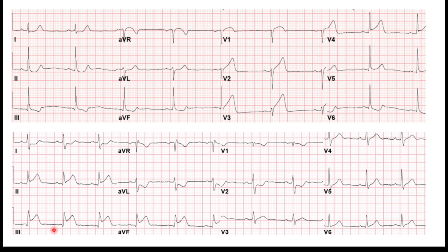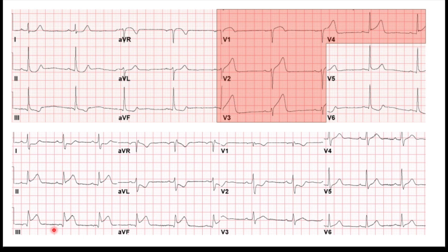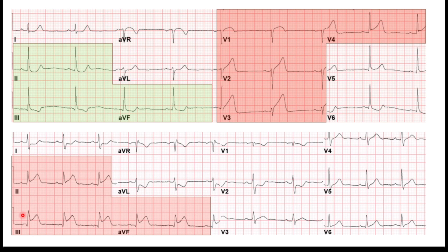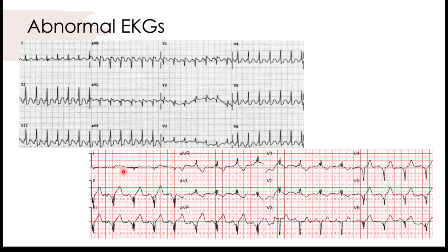On this top EKG, you've got a pretty typical anterior STEMI. We've got P waves, our rate is okay — maybe a little slow, but nothing we need to jump on immediately. Here are our anterior leads with ST elevation. V1 through V4 represent the anterior walls — this is an anterior STEMI. We have reciprocal changes, some ST depression, and a couple of flipped T waves in the inferior leads. The bottom one here is a pretty typical inferior STEMI look — inferior leads have ST elevation in 2, 3, and AVF, and our lateral leads have our reciprocal change.